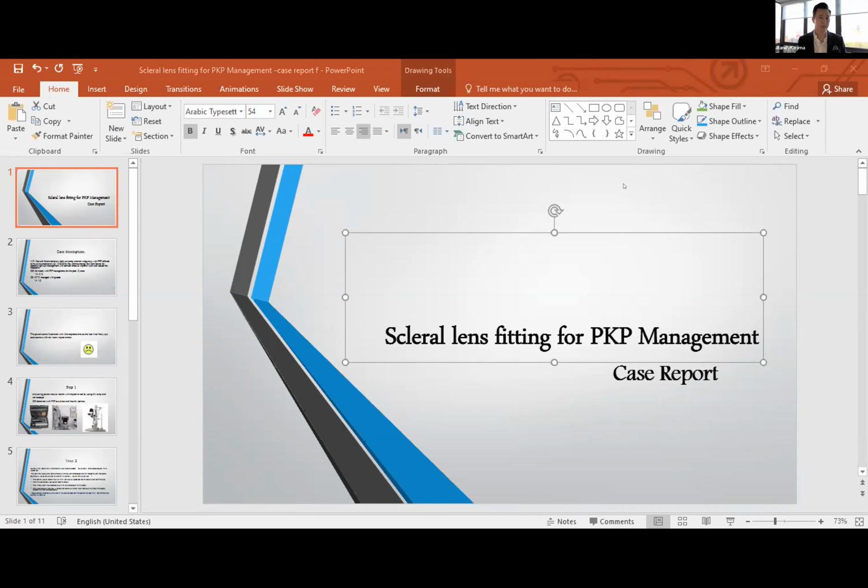And often, if for instance you have a toric Smartlens on eye, if the fluorescein comes in where the flat meridian scribe markers are, that means the lens is landing heavy on the steep axis, but it's lifting on the flat axis.